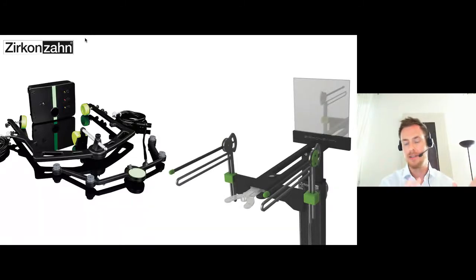And this plane analyzer device can be used together with a plane finder, our digital face bow. And this is phenomenal and great, because I'm able to register the whole patient in their natural position into the plane analyzer device. You're able to attach the plane analyzer anywhere on the patient's head, but then you don't have references. With a plane finder, we have references and a good starting point to reproduce all that information.